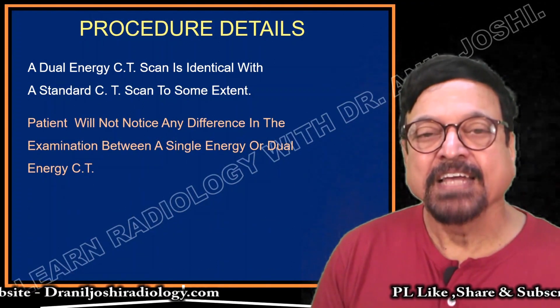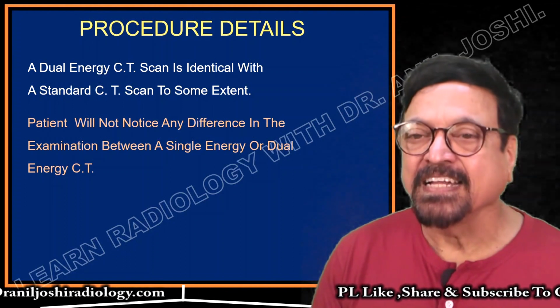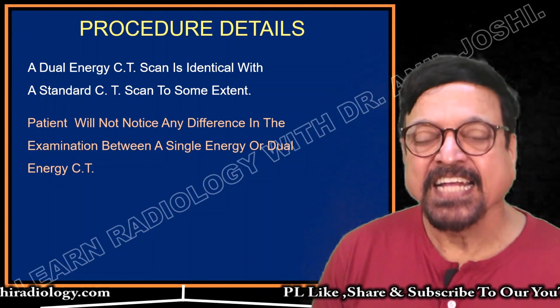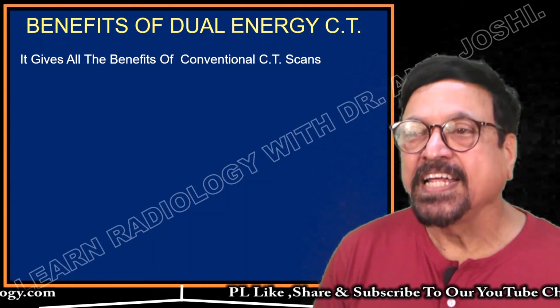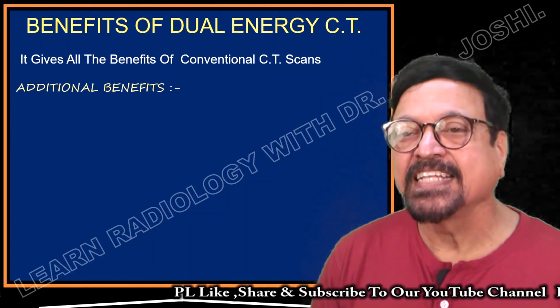Both tubes work like a standard CT unit. The patient will not notice any difference in the examination between a single energy and dual energy CT scanner. Now, a dual energy CT scanner gives all the benefits of conventional CT scans.